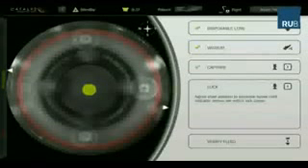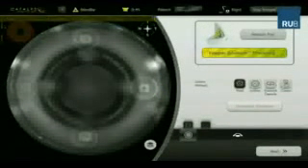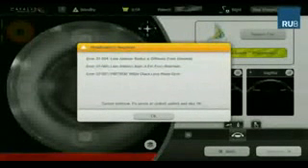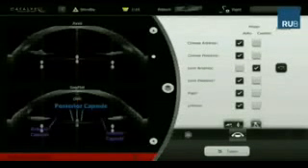The 3D spectral domain OCT is performed. In this case, the posterior capsule is visible with the OCT images and is marked so the image guidance system will treat it as the anterior capsule of the lens. The posterior capsule is usually bulged a little anteriorly underneath the anterior capsulotomy, which can be seen nicely in the axial and sagittal view of the spectral domain OCT.